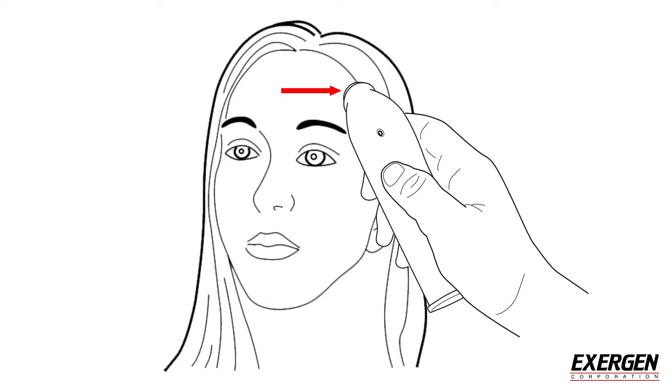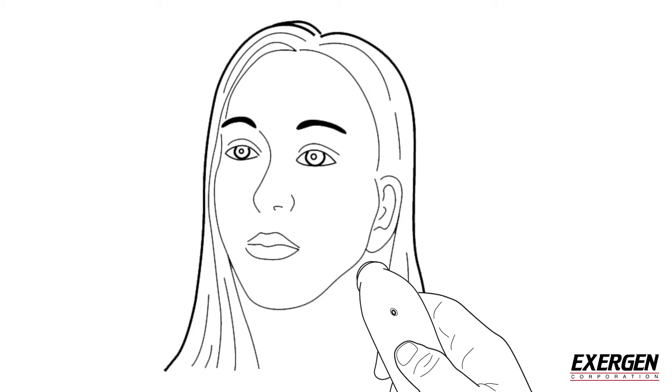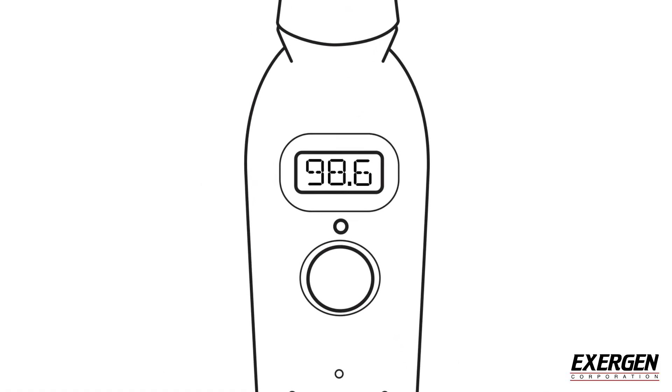Brush any hair aside if covering the ear. Lift the probe from the forehead and touch it on the neck just behind the earlobe. Release the button and read the temperature.